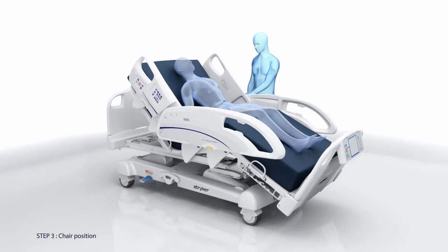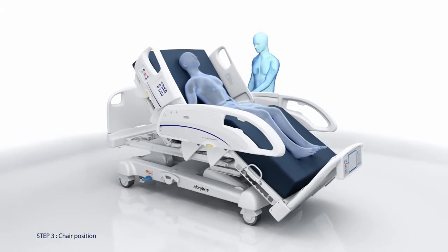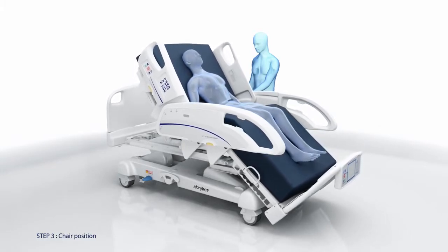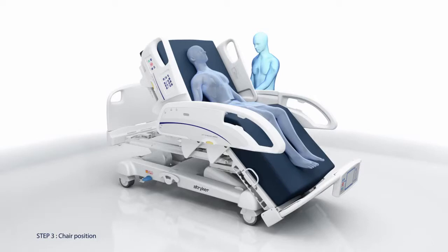Step 3 is to continue with the full chair position. The chair button will automatically articulate into 3 degrees of Trendelenburg in this position, and head of bed will be raised to 65 degrees. Because of bed rest, ICU patients can experience trunk or core weakness, reducing their ability to support themselves in an upright position. So this is why the Trendelenburg-like articulation is needed. Because of muscle deconditioning, sitting in an upright position serves as muscle strengthening exercises, as well as hemodynamic and orthostatic training.